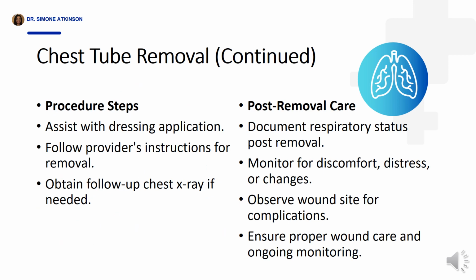Provide support in properly applying the dressing following the chest tube removal, and ensure the wound site is adequately covered and secured. If it's advised by the healthcare provider, arrange for a follow-up chest x-ray, as this will confirm lung re-expansion progress as well as assess healing. Record the client's respiratory status after the chest tube removal, and maintain vigilance for any changes or complications.